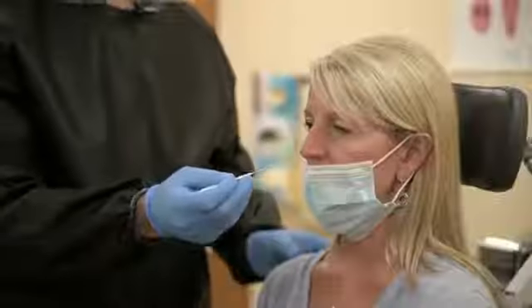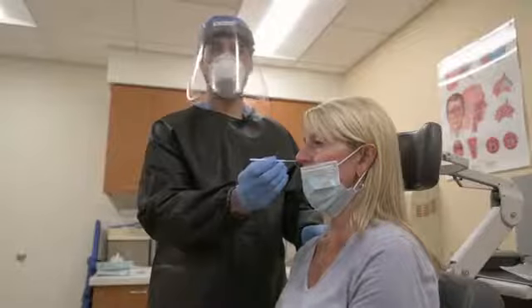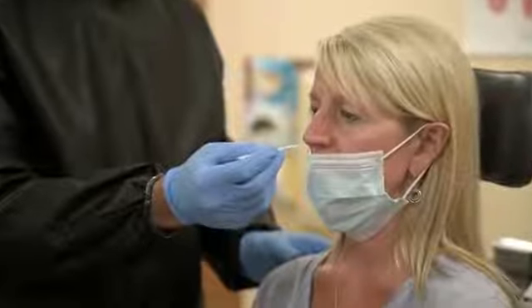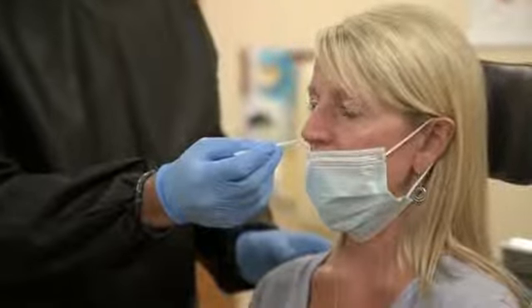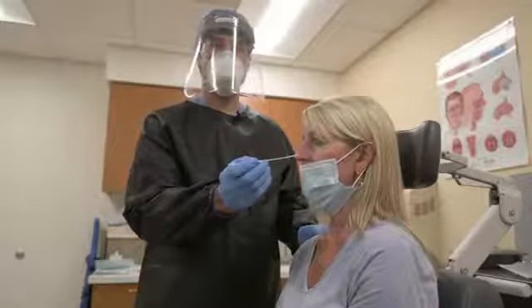Another problem you may encounter is if you meet resistance prior to reaching the nasopharynx. With these swabs, you may be able to gently extend past the obstruction and reach the nasopharynx. If you cannot, gently remove the swab and make sure you're able to reach the nasopharynx on the other side.